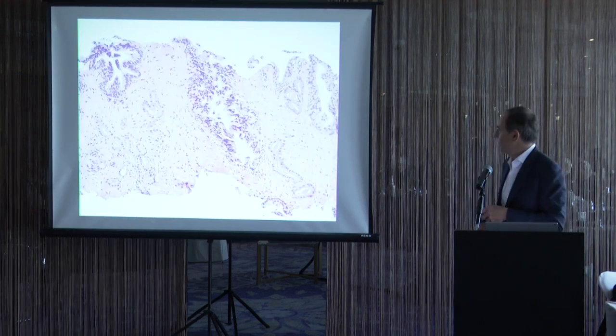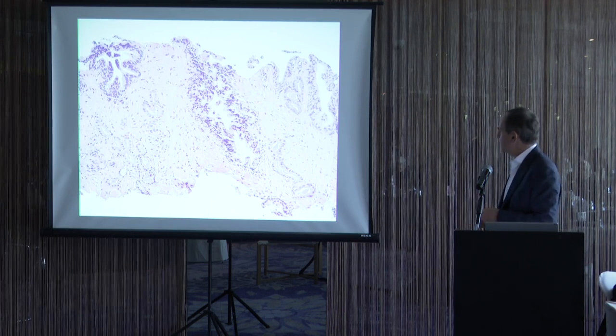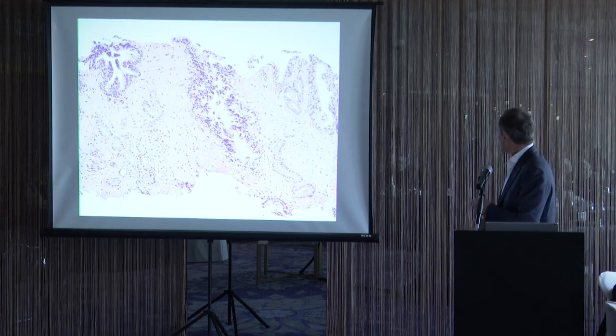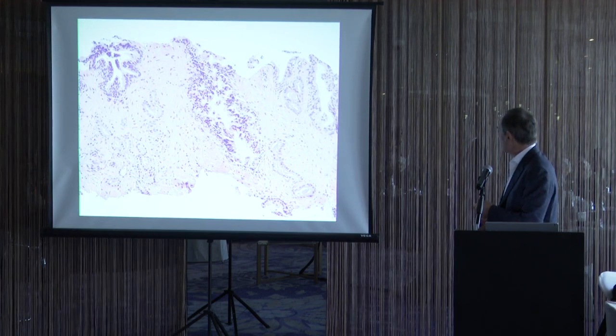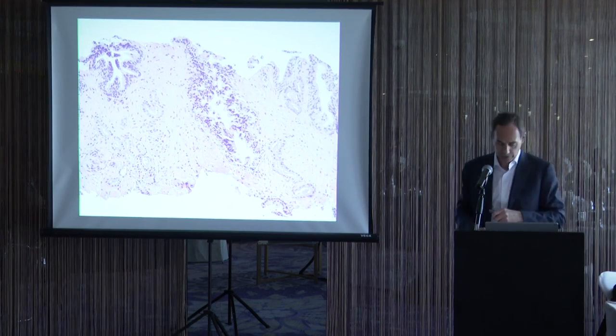So here's a case where maybe you had this focus here at higher magnification, you didn't see any nucleoli, you favored strongly it was cancer, but maybe you weren't 100% sure. The fact that you can see the same glands on the other side of the benign gland tells you it's an infiltrative growth pattern and allows you to make a definitive diagnosis of cancer.